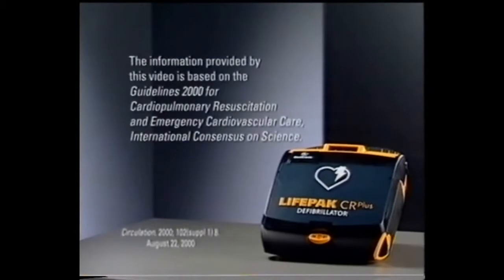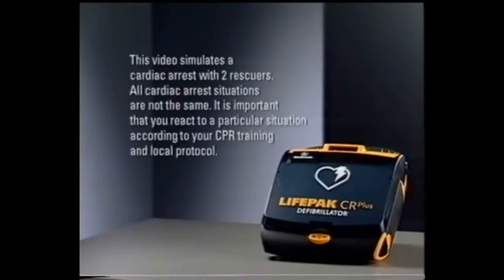The information provided by this video is based on the Guidelines 2000 for Cardiopulmonary Resuscitation and Emergency Cardiovascular Care, International Consensus on Science. This video simulates a cardiac arrest with 2 rescuers. All cardiac arrest situations are not the same. It is important that you react to a particular situation according to your CPR training and local protocol.